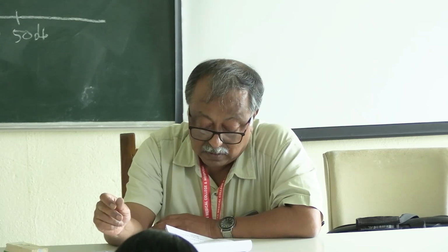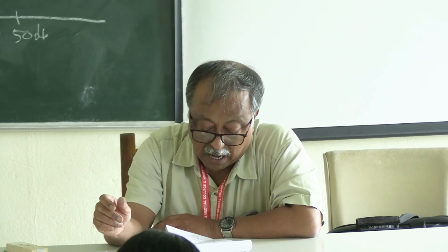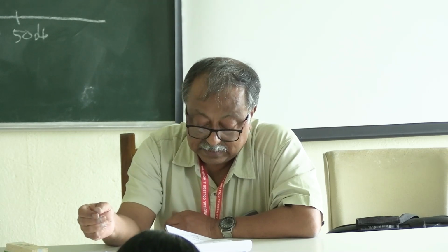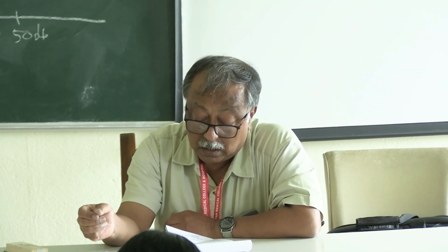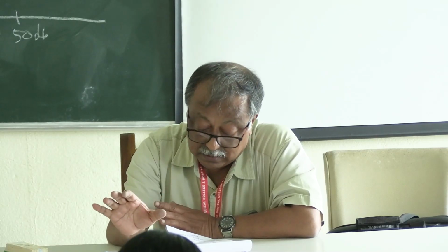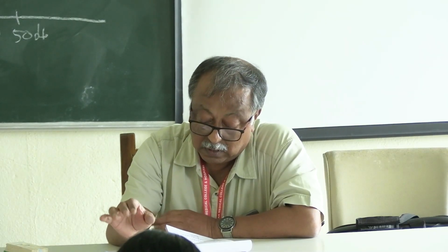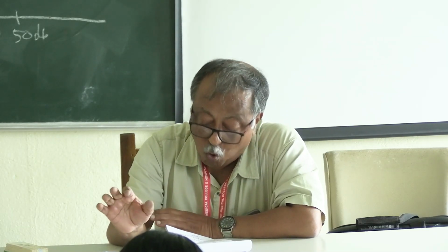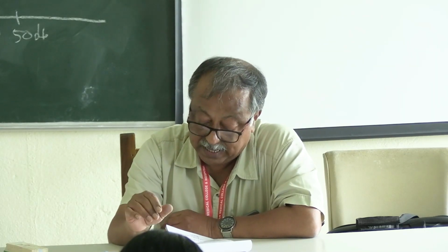Retrocochlear lesion like acoustic neuroma, we will get it. Normal ear, they can hear a sound for 60 seconds. The tone of 4000 hertz. Here it is 4000 hertz.